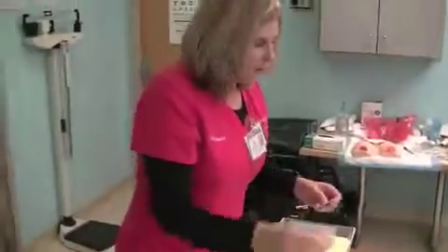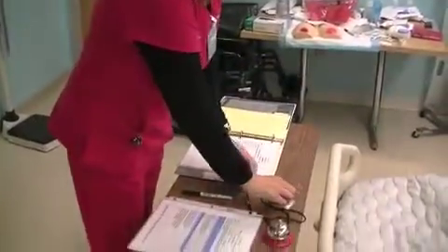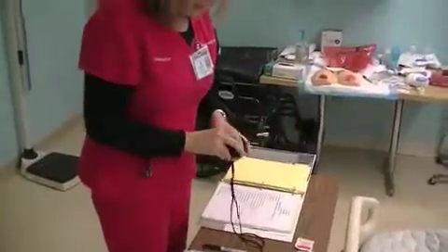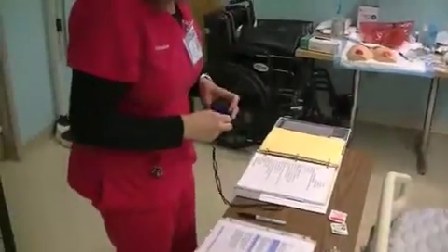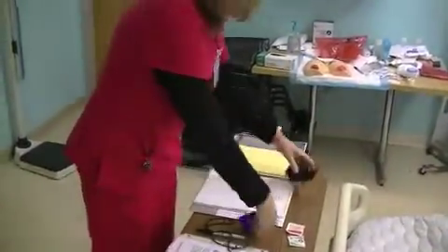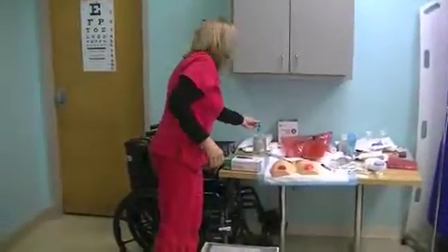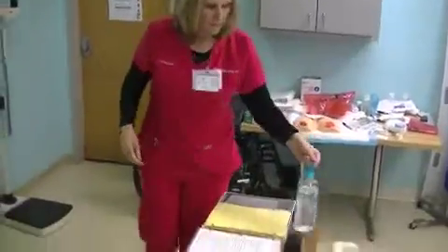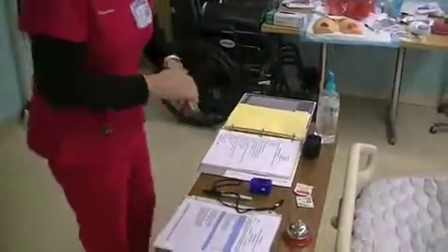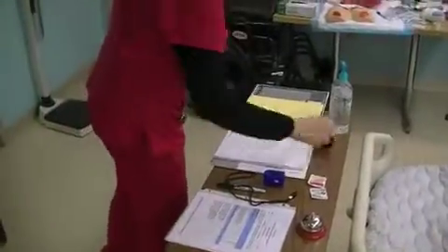We're going to need a nail polish remover pad if they have nail polish on. We're going to need an alcohol wipe to clean the finger, and we're going to need a pulse oximeter. So the first thing I'm going to do is wash my hands. And I'm going to get ready to go into my room, knock on the door and introduce myself to the patient.